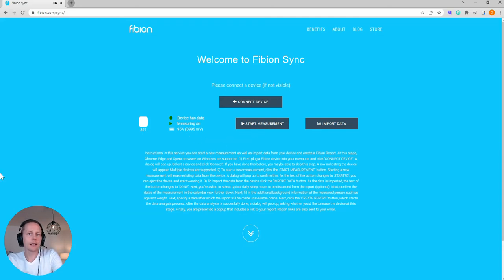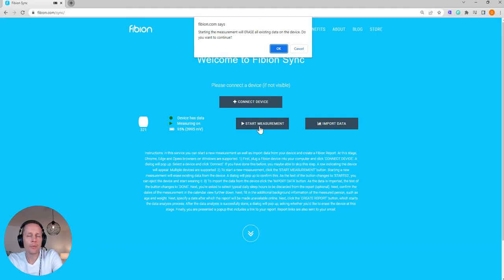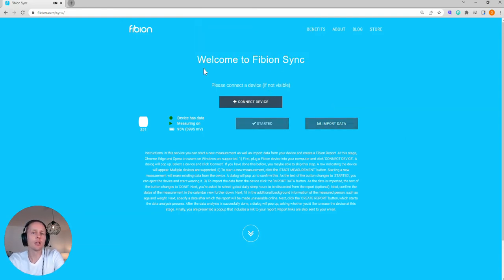I can go and click 'Start Measurement' and it will say that starting the measurement will erase all existing data on the device — do you want to continue? In this case I want to, because I know there's no important data. If there were important data, I would go to 'Import Data', save it, and create the reports before doing this step. But now I'm sure I can go on.